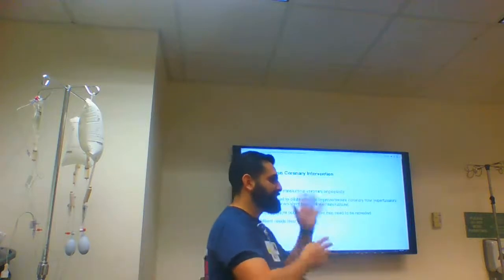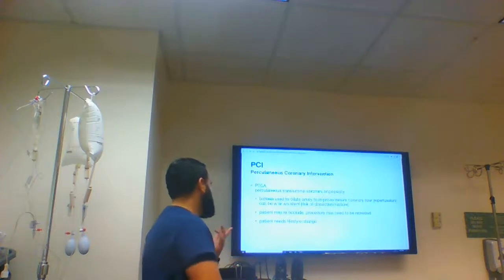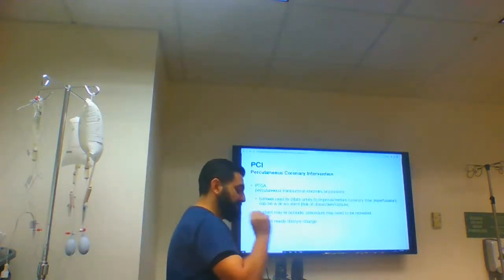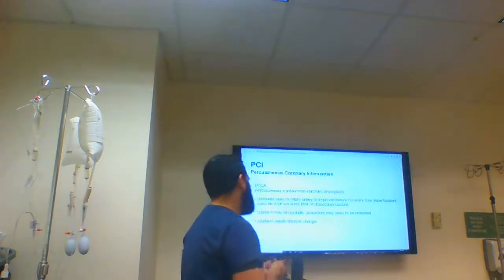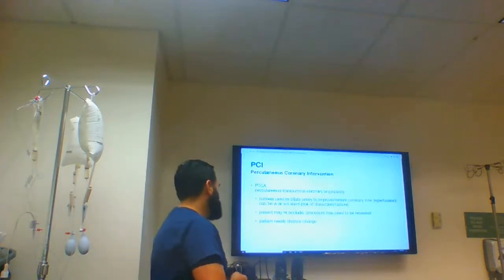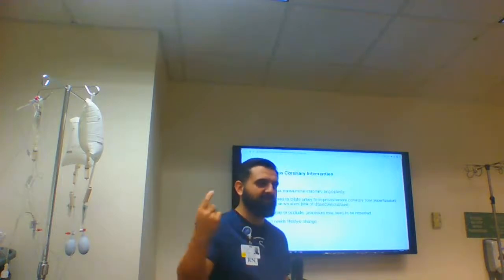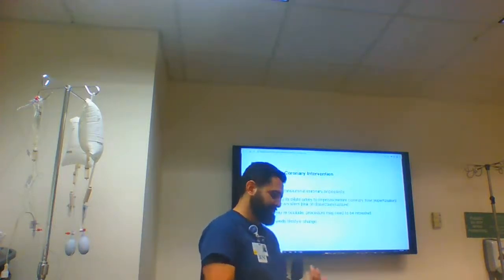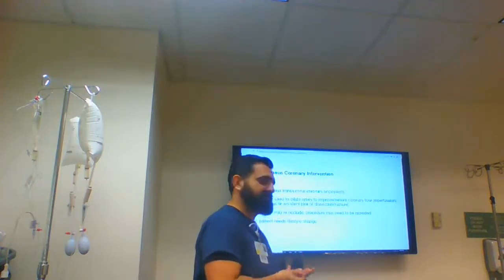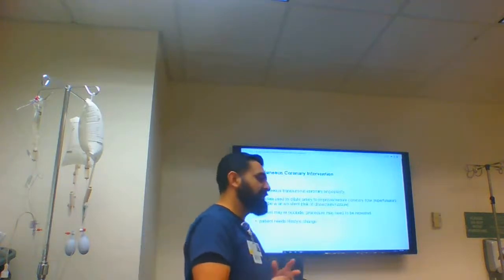So 70% lesion, improve flow; STEMI, restore flow. Of course, reperfusion can be with or without the stent. However, anytime we inflate inside the coronary vessel, we have the risk of dissection or rupture. Patients may re-occlude, so the procedure may need to be repeated, and you have those patients that keep coming back and coming back. Sometimes it's a non-compliance thing, sometimes it's hereditary. The vessel just doesn't like the stent there.